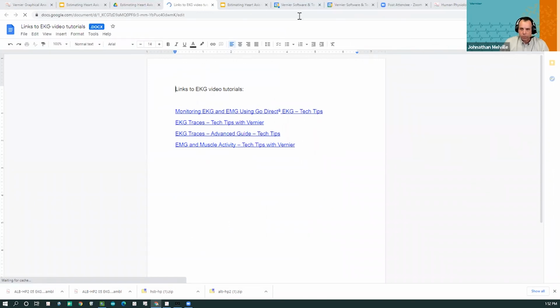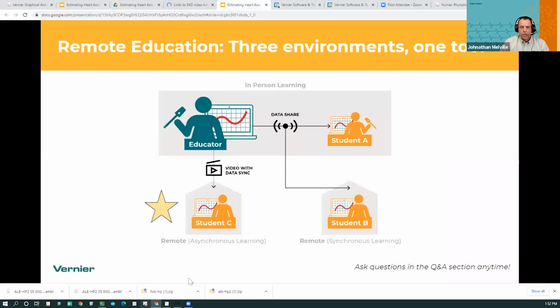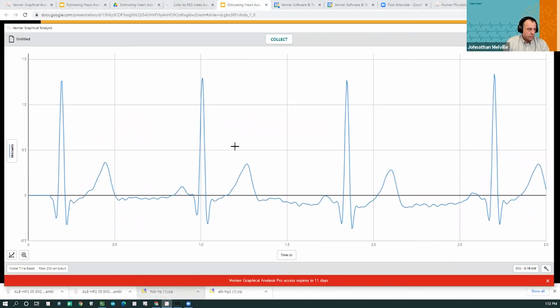And that's in the folder that you should be in. No, these are not specific. The reason why we use our tabs is because they're very affordable, right? A package of like 100 is incredibly affordable. So we know that money can be an issue, so we try to get the most affordable ones. The snap-on EKG tabs work great, they're very stable and less prone to noise, but you're going to pay more, like $20 for 50 or something like that.